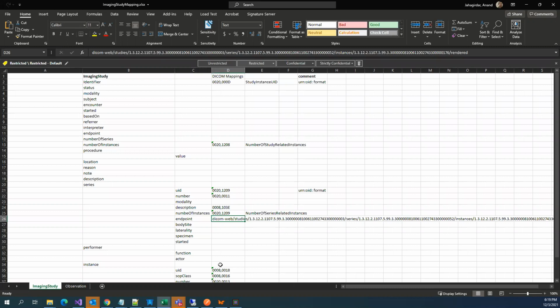One more follow-up question. Do we need to set up all those open source tools listed as part of the track for tomorrow's session? Not for tomorrow's session. Tomorrow, there is one URL where you can try Scriban templates. On the left side you can have a JSON, on the right side the template, and on the far right you'll see the result. Whatever you type, it'll start showing. So tomorrow you don't need it, but for Connectathon it would be good to have those things.